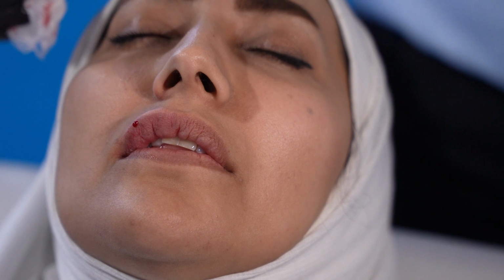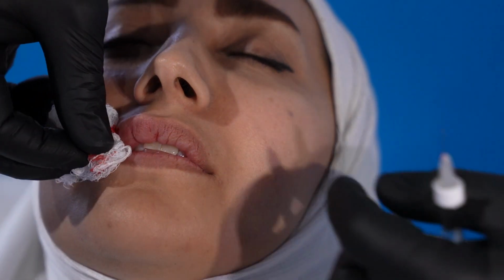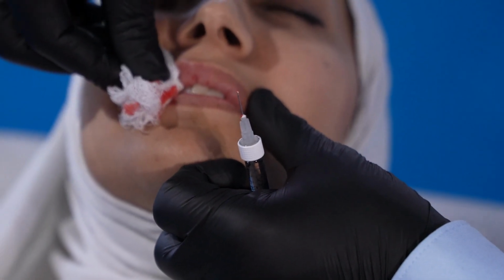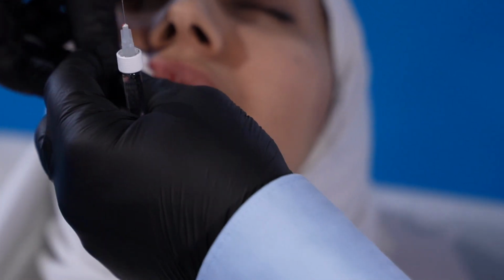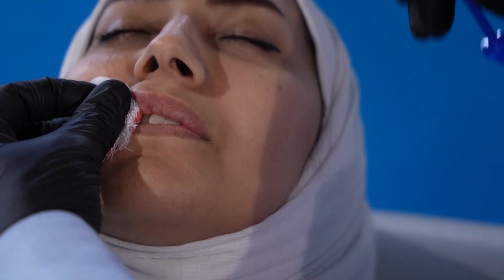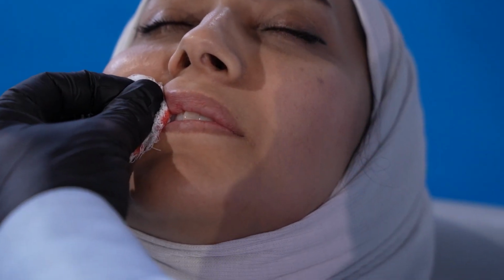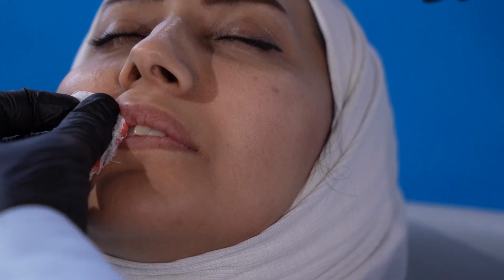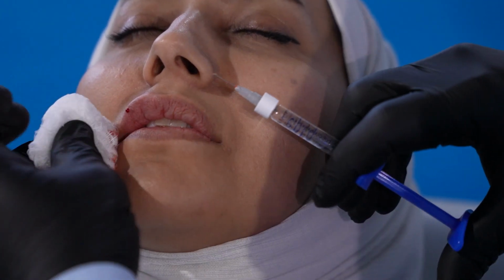I don't know whether it is clear for you or not, but the first puncture. At the same time, so that our hand will not forget the memory of the type of the injection and the volume that we injected there, we'll go to the other side.